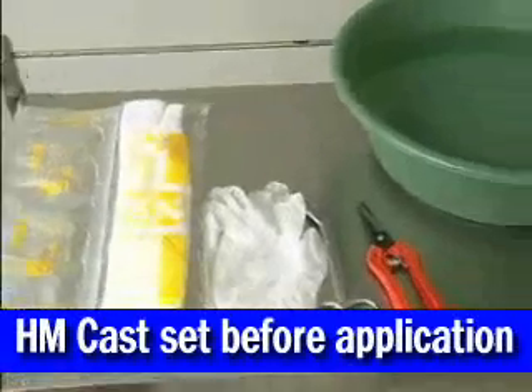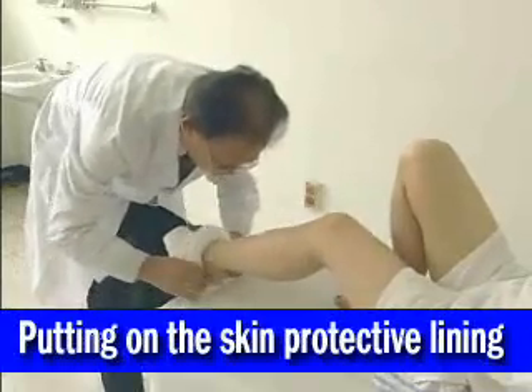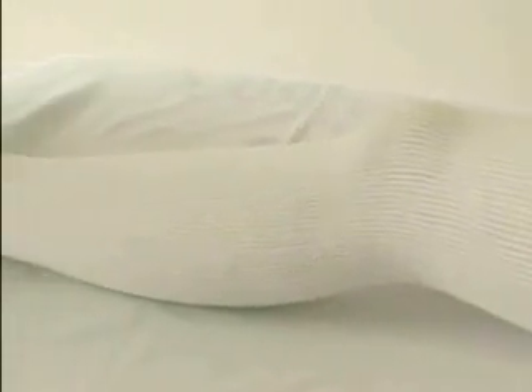The HM cast is very simple and easy to apply. Let's follow this demonstration. First, roll up the protective lining over the affected area as if putting on a stocking, and leave surplus material so that it can be folded up and over the cast later.